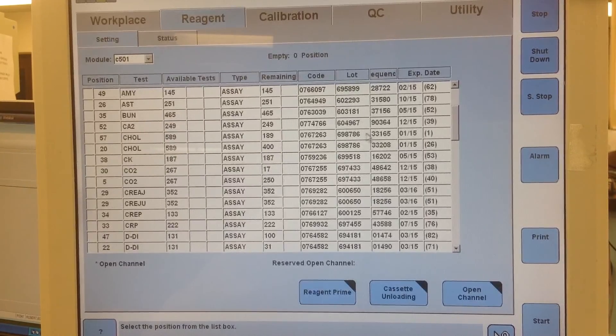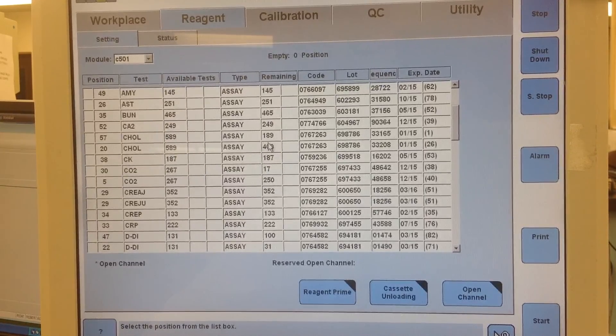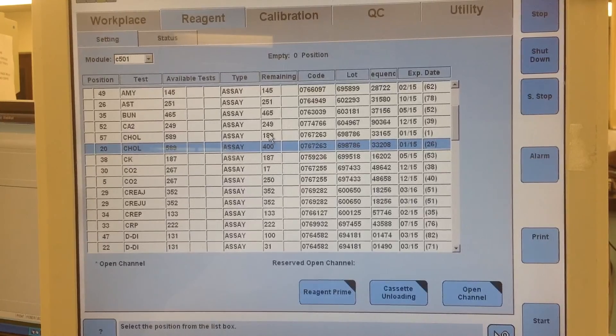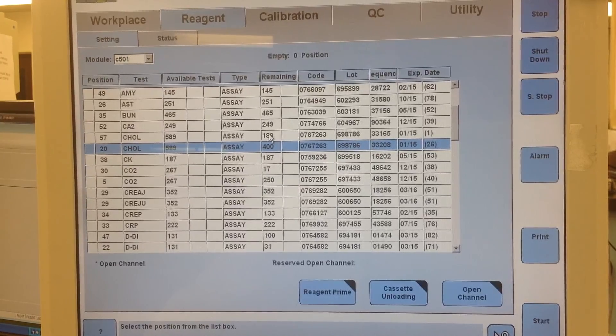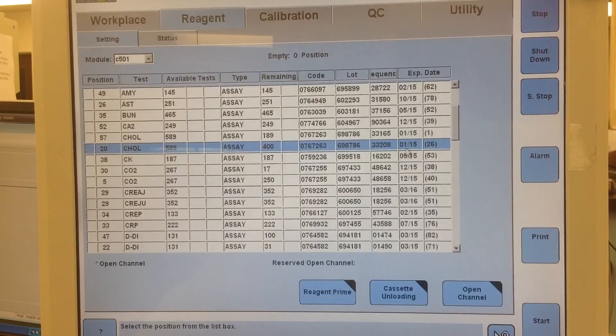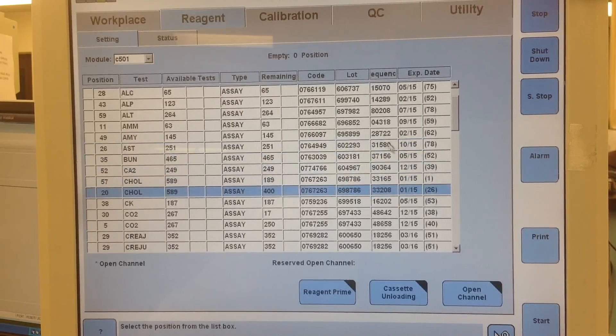I actually already went ahead and put another pack on. Unfortunately there's 189 still remaining but it's going to expire tonight at midnight, so I'll go ahead and dump it then.